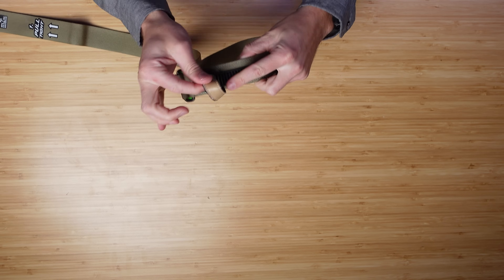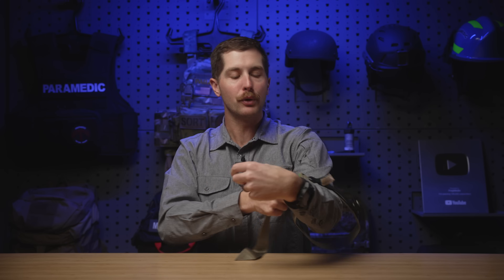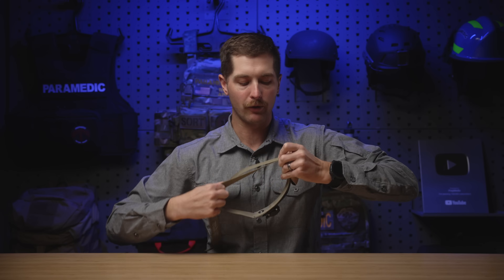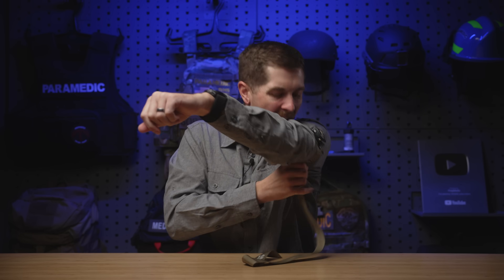Obviously everything has a failure point. With any kind of friction-lock tourniquet, when you do this for self-application, the hard part is I can't just put this up my arm and pull it — it's not going to move no matter how hard I pull. I need something to pull against, and that's where this bite strap comes in. If you're putting it on somebody else, you can just use that to tighten it — super user-friendly. But if I'm putting it on myself, I can use this as a bite block, take it in my teeth, and tighten it just like that.